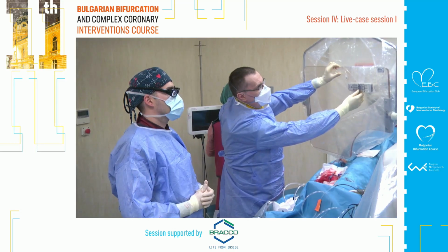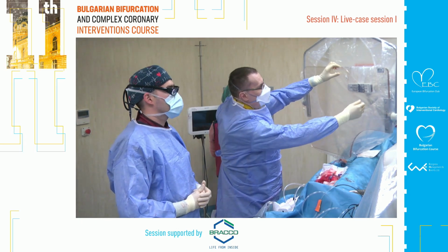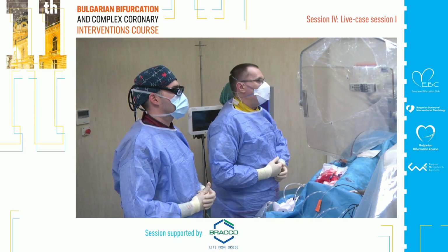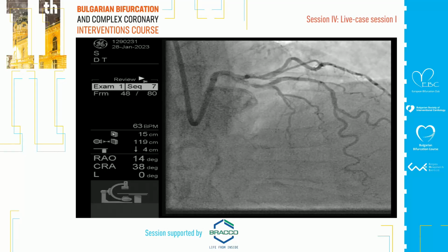The patient came for this proximal LAD, very tight stenosis. And on the next projection, you can appreciate that there is a huge amount of calcium, even without contrast.